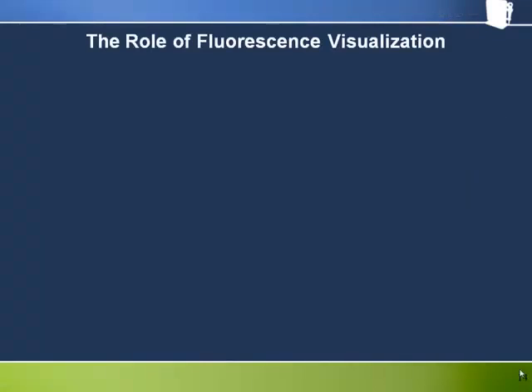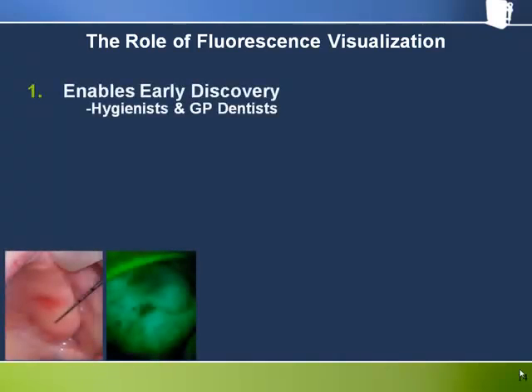Although we have focused in this introduction primarily on the use of fluorescence visualization in everyday use, it's important to understand that its role as a tool in dentistry can depend on the context of its use. As we have seen, for the primary care practitioner, such as a dentist or hygienist, it's primarily an early discovery tool, highlighting areas for further investigation that otherwise might have been overlooked.